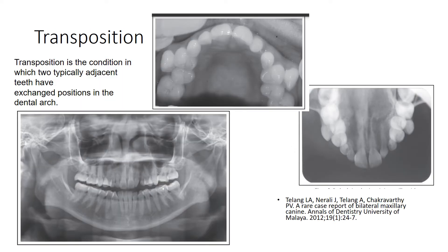Transposition is a condition in which typically adjacent teeth have exchanged positions in their dental arch. This is an example of a case where the canine and premolar were transposed on both sides of the maxillary arch.